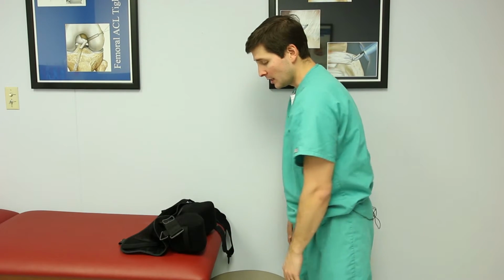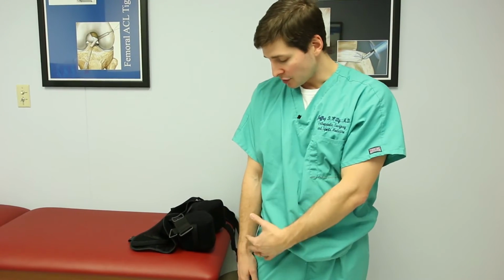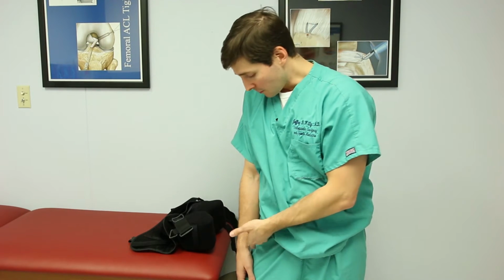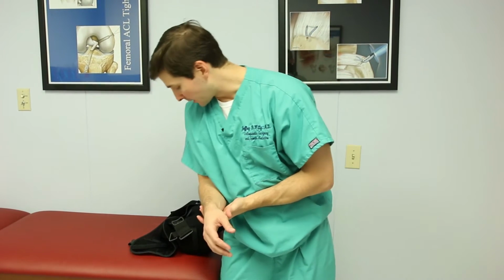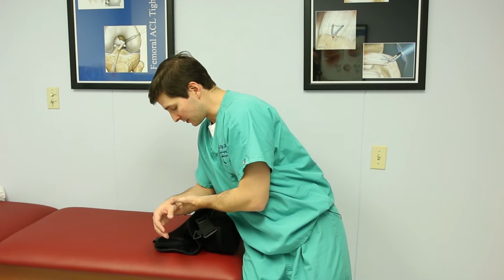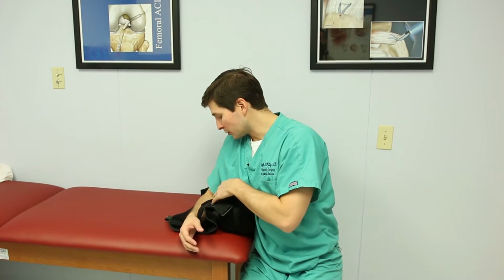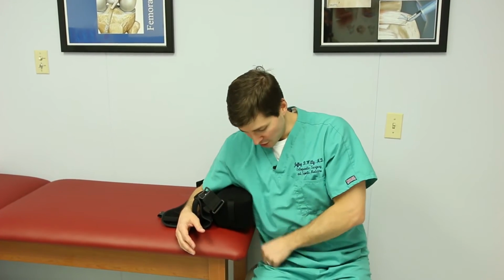so that they're easily accessible. What we'll do is step closer to the table while making sure we keep the injured arm still at the side, and then we take the uninjured side, reach it around, and just support the forearm just like this. Now that we've got the shoulder supported, we'll take a step a little bit closer to the table, and we're just going to lean over just like this. Then we'll slowly lower ourselves down into the sling like that, so that the shoulder is supported by the table. Now I can adjust myself in the chair.